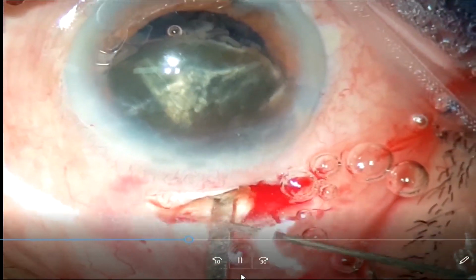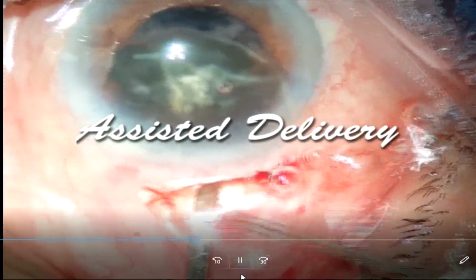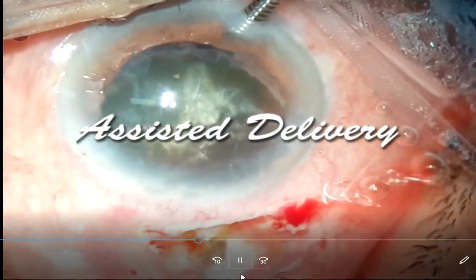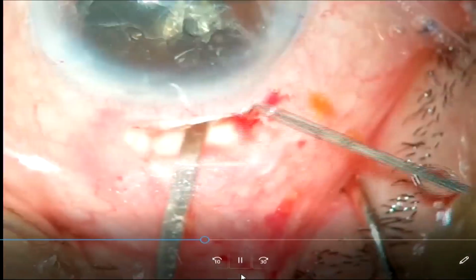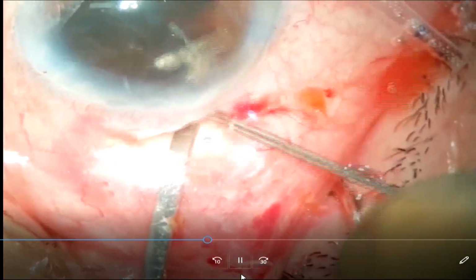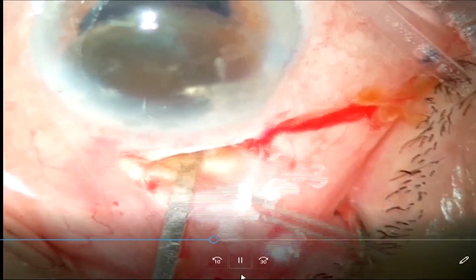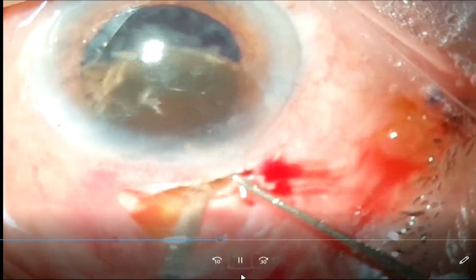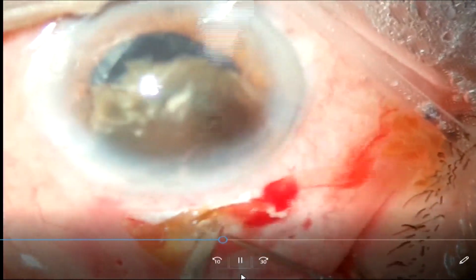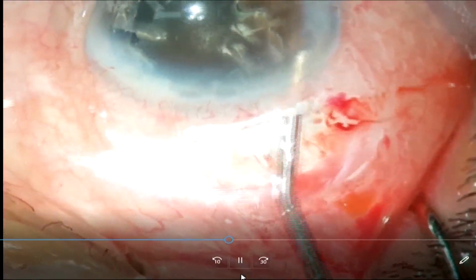After that, this is an iris repositor which is placed behind. I keep pressing on the sclera. The fluid is on, and the needle in the other hand is chipping the nucleus so that the nucleus becomes smaller in size. As the nucleus becomes smaller, you can keep pushing it back to engage the smaller diameter. And eventually, as the nucleus engages into the internal tunnel, suppose the nucleus does not engage, that means your internal opening has to be enlarged.